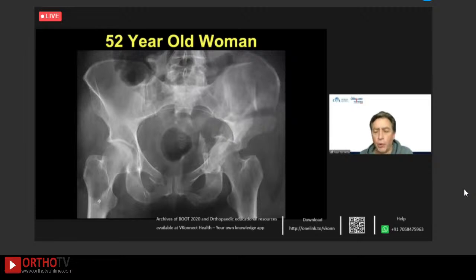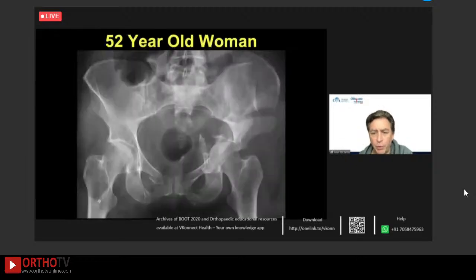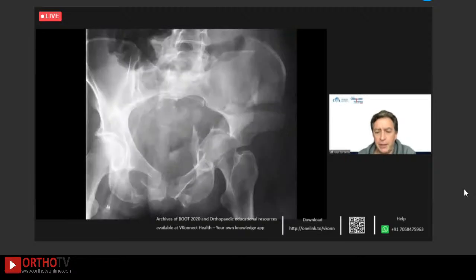So here's a little more of a bad case. This is a 52-year-old, really pleasant woman who had this injury. I'll let you look at that for a second because it's not a quick evaluation. And here's the oblique. So it's obviously a both column, but also there's an iliac wing fracture, so it's not isolated to that. With a lot of comminution, a separate posterior wall fragment that you can see, and a lot of medial comminution of the quadrilateral surface.